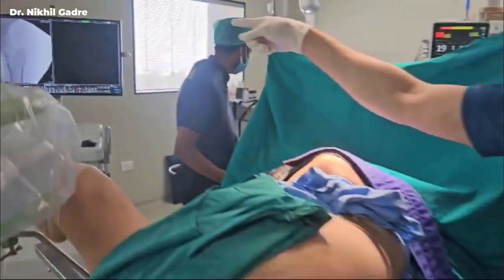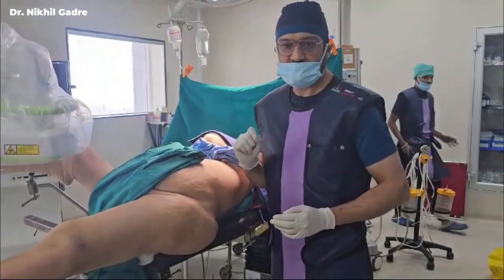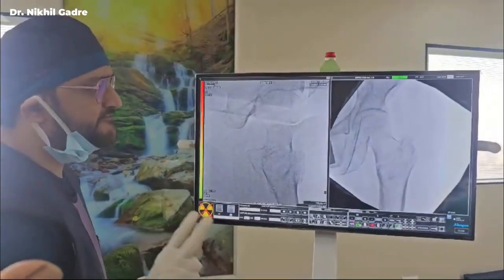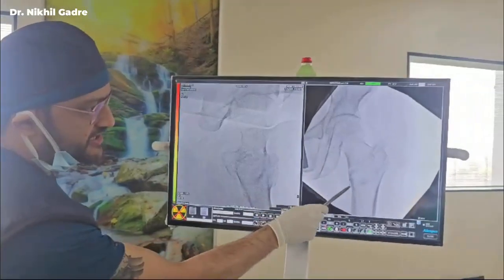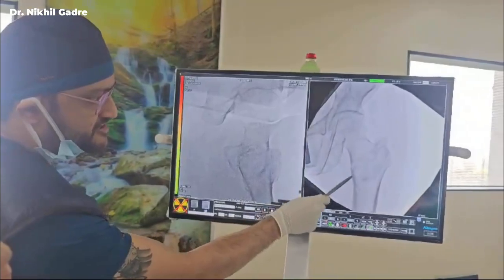The lateral reduction is very important in intertrochanteric fracture. So you just take a look at the lateral X-ray as well. This is the lateral reduction. The two most important factors in anatomically and perfectly reducing intertrochanteric fracture is first, the medial continuity line. The Shenton's arc should be maintained. See how perfectly the medial arch is maintained.